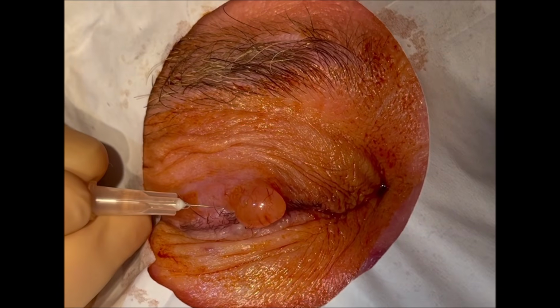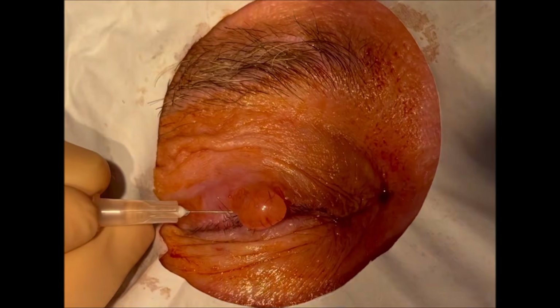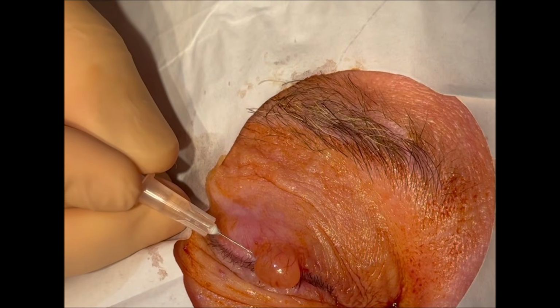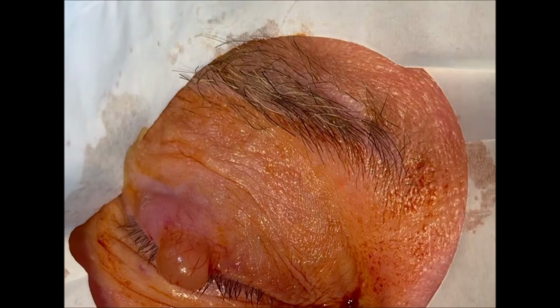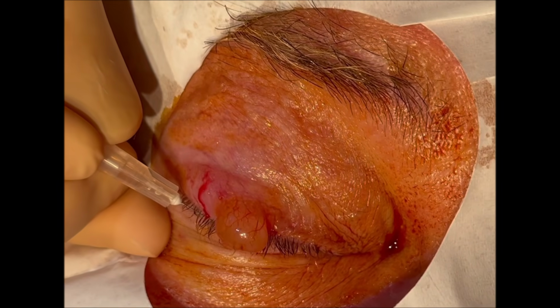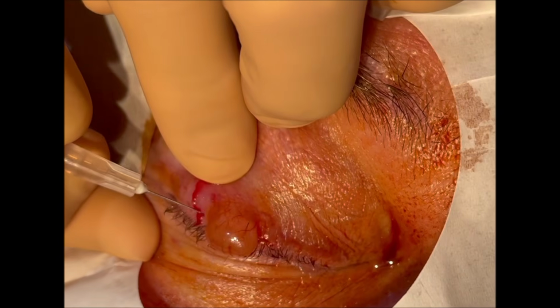So I'm injecting, again, lidocaine with epinephrine around the lesion, underneath the lesion. You can see the blanching of the skin. In other words, you can see the whitening of the skin around the lesion as I'm injecting the epinephrine, because the epinephrine vasoconstricts the vessels. And this is all done with local anesthesia, no IV sedation.